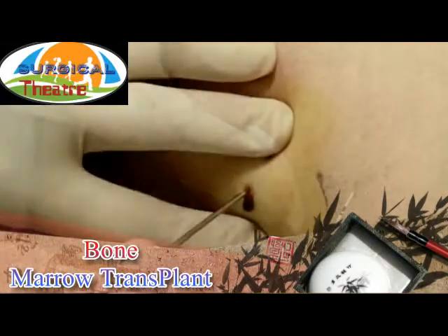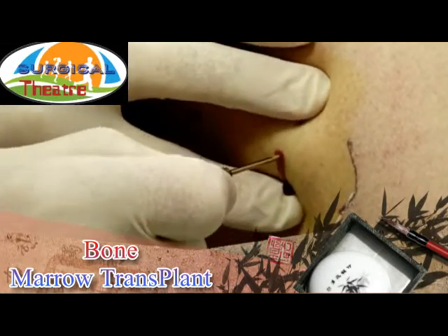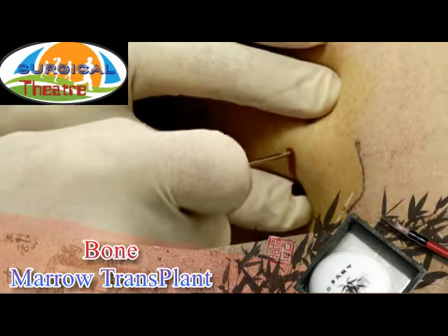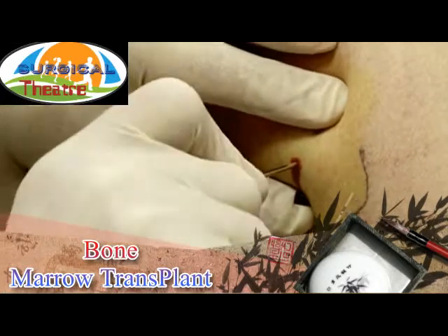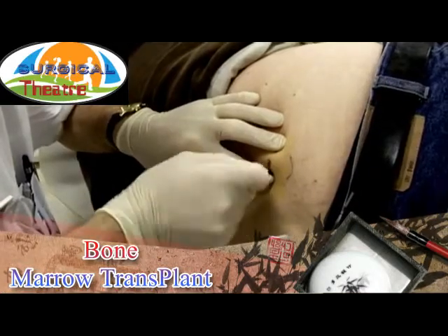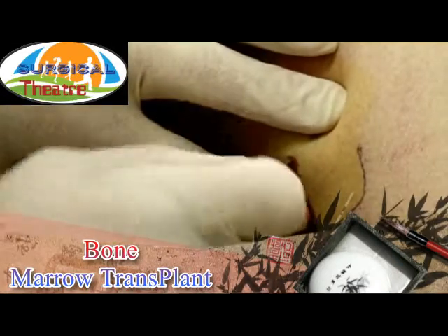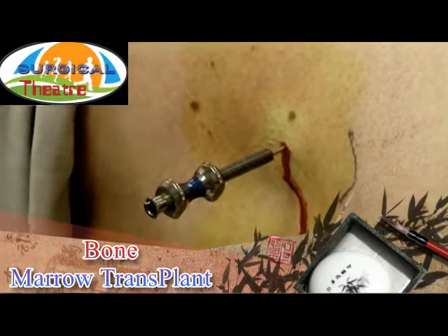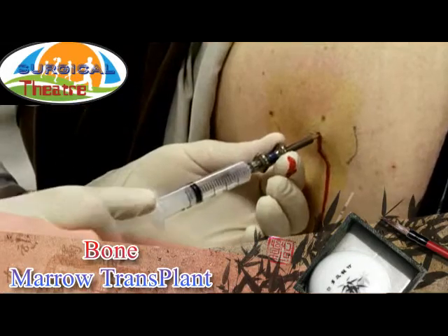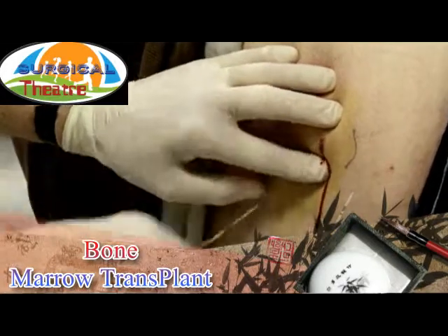Disposable and reusable aspiration needles are available; a reusable needle is used in this video. The needle is pushed toward the posterior iliac spine and rotated with careful pressure until it goes through the cortex. When the needle is in the spongy tissue, the trocar is removed and a 5 milliliter syringe is connected. 0.2 to 2 milliliters is quickly aspirated for a regular bone marrow smear.